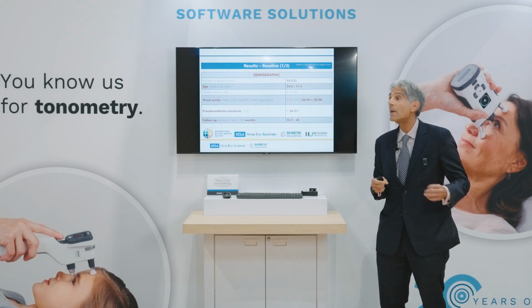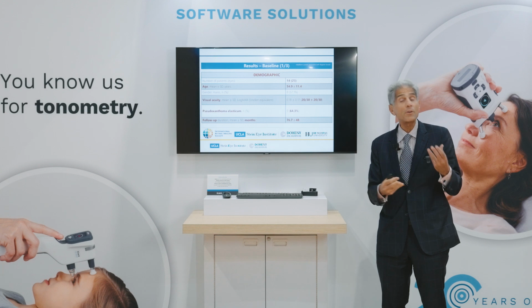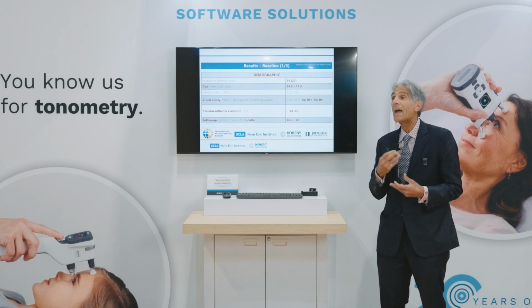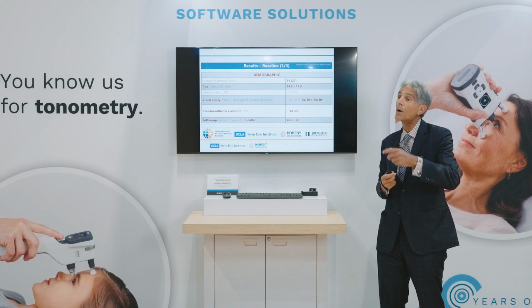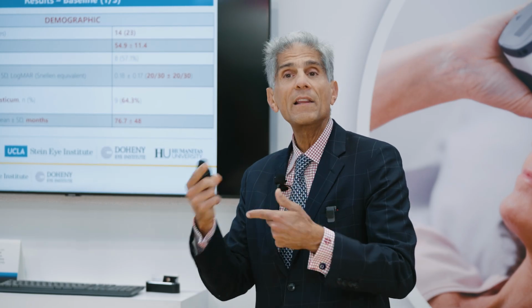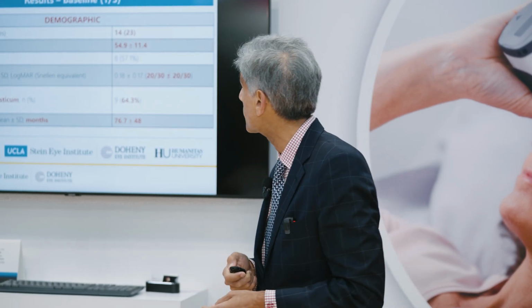And presumably what's happening, the angioid streaks are, again, a sign of an abnormal Bruch's membrane, perhaps a calcific elastin component of the Bruch's membrane, and this leads to RPE impairment, and then that leads to this deficiency in phagocytic function, causing the vitelliform material to accumulate.